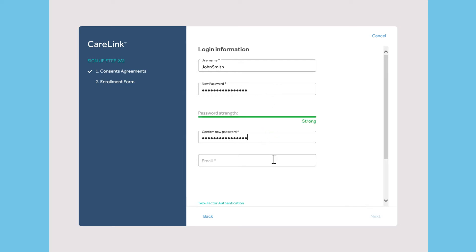You will need this information to log in to CareLink software from a personal computer and when you use applications that link to your CareLink account.